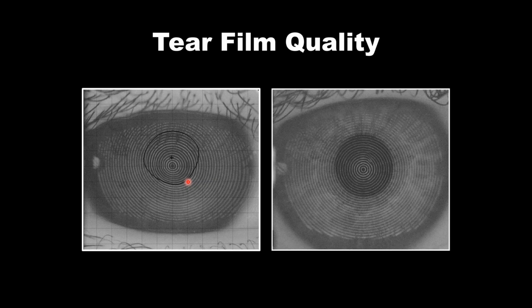So if you have tear film breakup, then you're going to have a problem understanding the underlying cornea. Now this image isn't so good because the lids are in the way, we've got some eyelash shadows, but if you look at the rings, they actually look pretty good. They're parallel and even. So we need to open up the fissure, but the actual tear film looks good at the instant we took this capture.